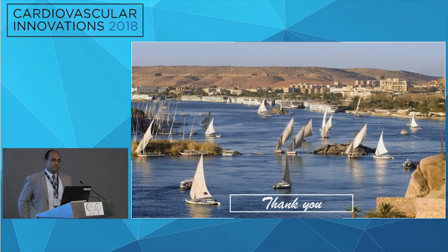didn't quite make a loop. I think it was Mark, right? So they actually captured the wire within the left ventricle and just by pushing a catheter, I think it was a multipurpose or whatever the looping wire was, actually into the apex, created enough strength to push a whole TAVR system across a valve. So I wonder if you actually need the whole loop, or if you can just snare your wire in the apex and just push down with the catheter as well. Makes it maybe even slightly easier.